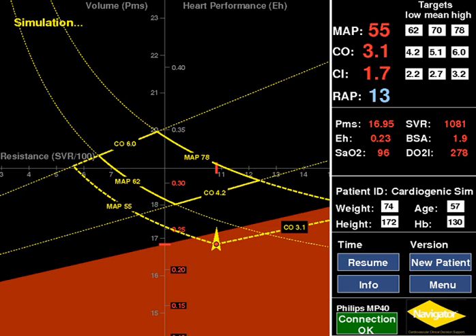Additionally, in this case study, the red zone in the lower right corner of the display is prominent. The upper boundary of this zone represents a critically low oxygen delivery index, DO2I, of 300 mls per metre squared per minute. Ideally, patients should not be in the red zone.